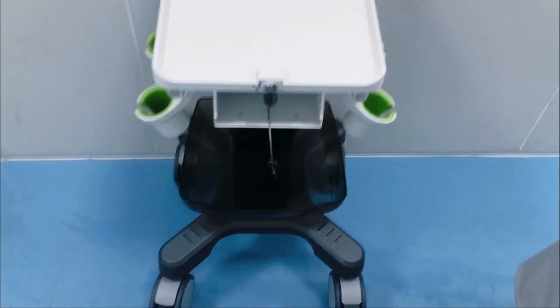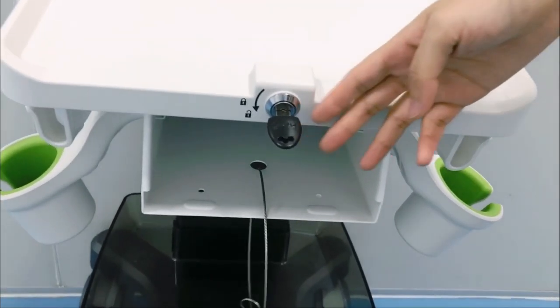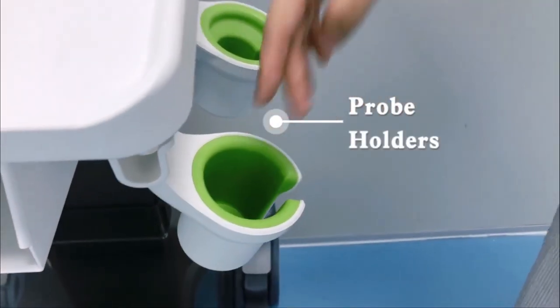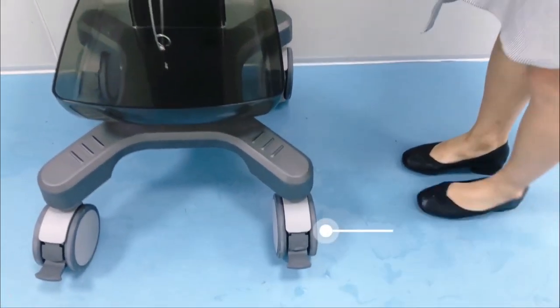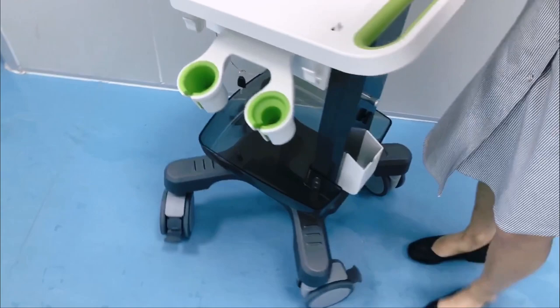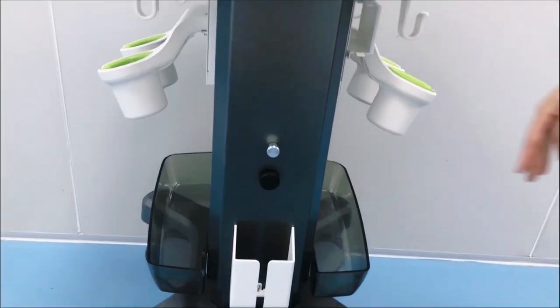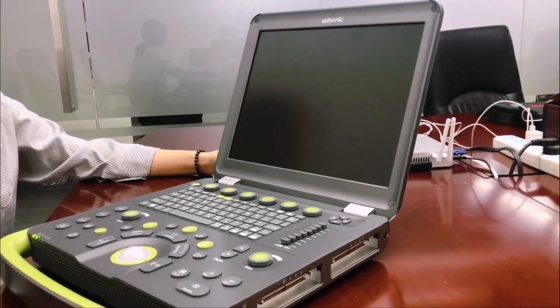As for the trolley, there is a built-in anti-theft lock for higher security, a large storage basket to contain more items, and probe holders. Four rubber silent casters, each lockable individually. The lift range is 200mm to meet different clinical scenarios.